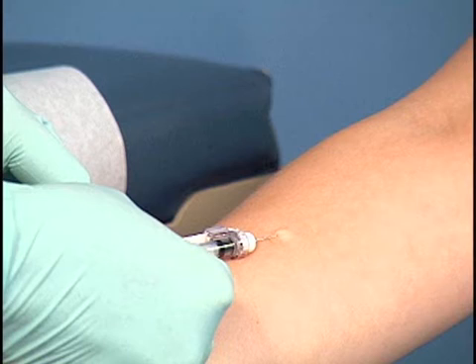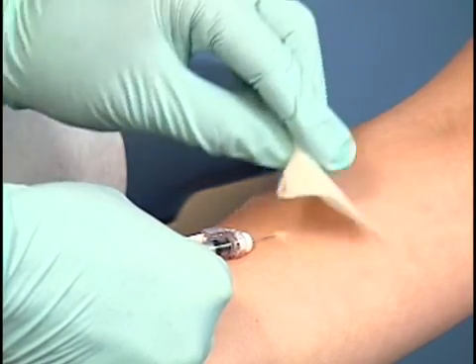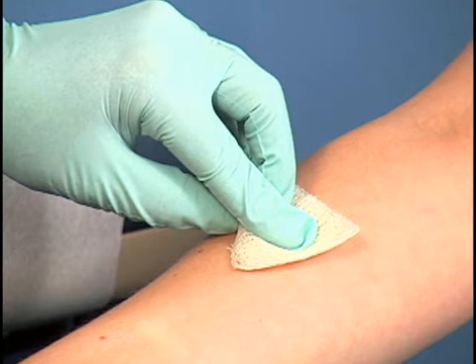If a wheal does not form, repeat the test at a site at least 2 inches away from the first test site. Place the gauze pad over the injection site and quickly remove the needle, keeping it at the same angle for insertion. Do not apply pressure to the injection site.